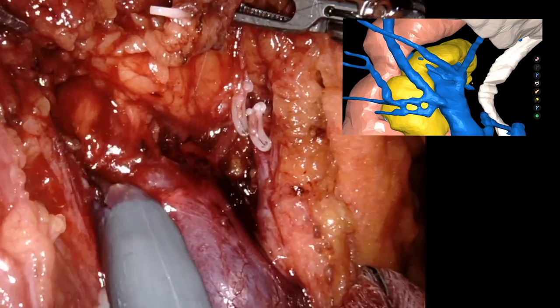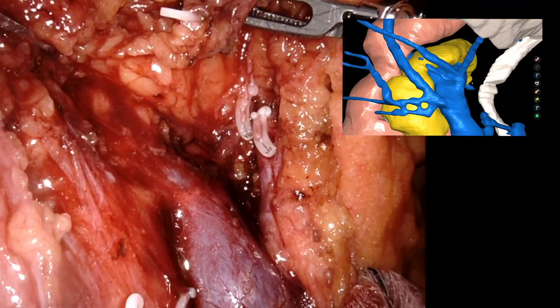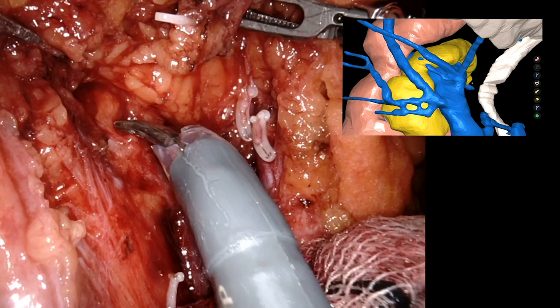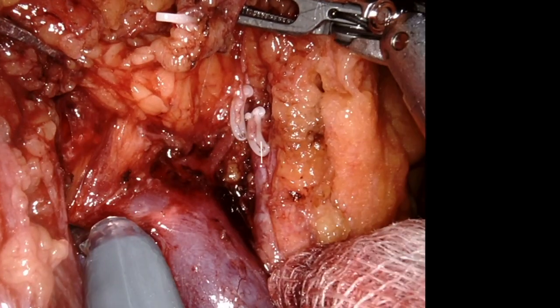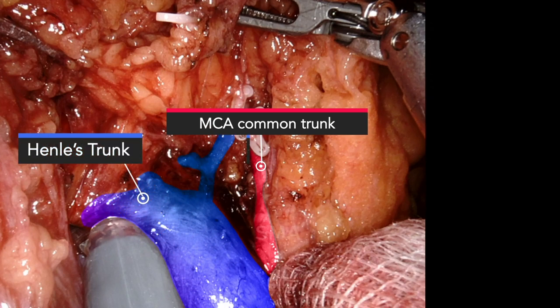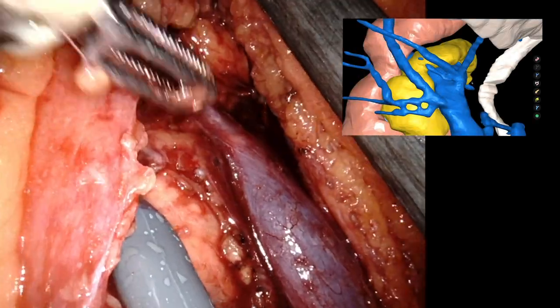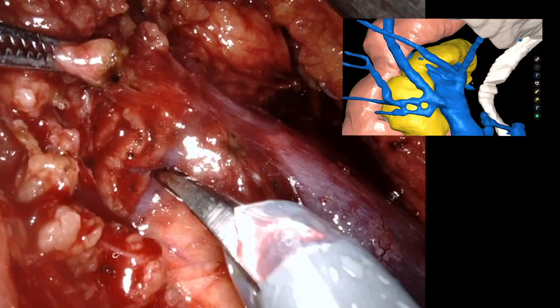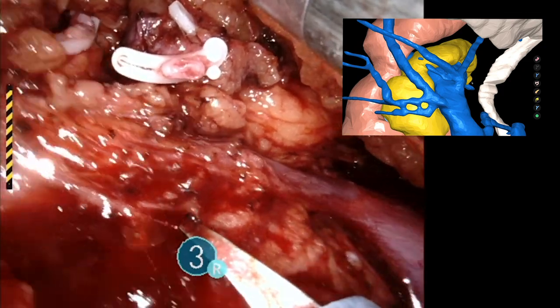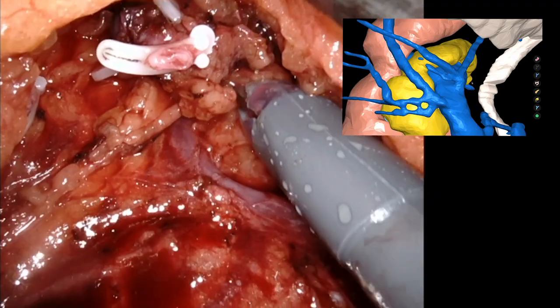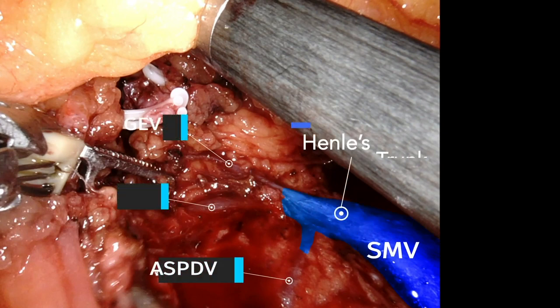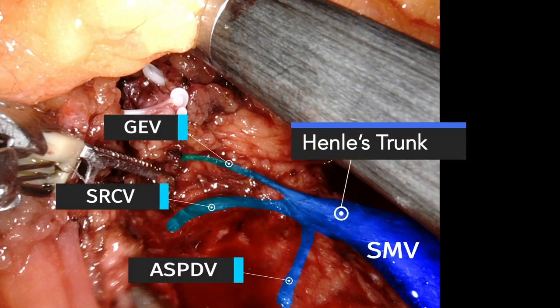Henle's trunk can now be visualised draining into the right lateral aspect of the SMV. As demonstrated on the 3D reconstruction, Henle's is formed by the confluence of the gastroepiploic, superior right colic, and anterior superior pancreatoduodenal veins. After each vessel is identified, the superior right colic vein is selectively clipped and divided, preserving the remaining veins.